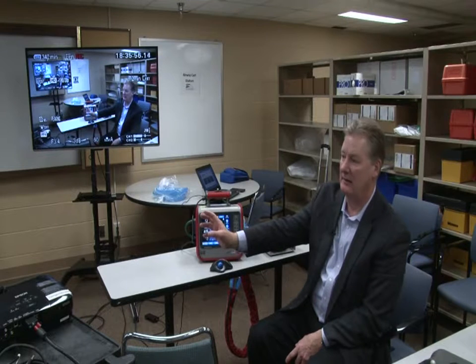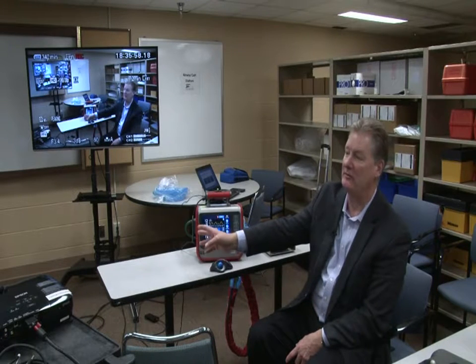And the next thing will be you put a Bluetooth chip in there, and it talks to the communication system on the ambulance, and it broadcasts on a screen to your medical command. So if you have a problem, you go, hey Daniel, I'm having a problem, and he goes, oh, let me take control of the ventilator, and he tweaks the controls. That's going to be the next thing probably. So there's already talk about putting Bluetooth technology into the ventilators.